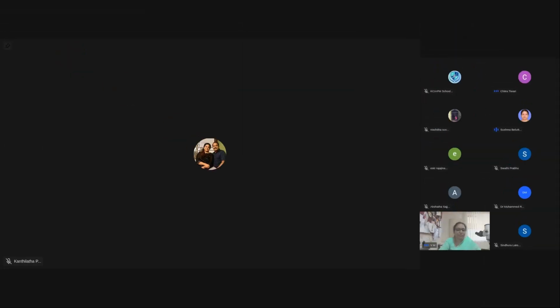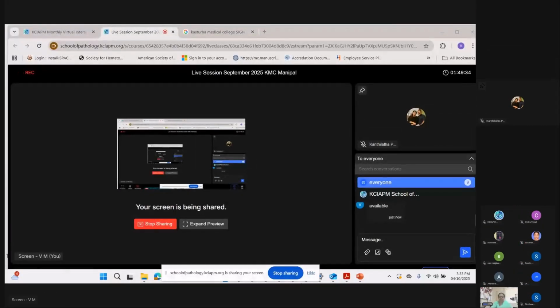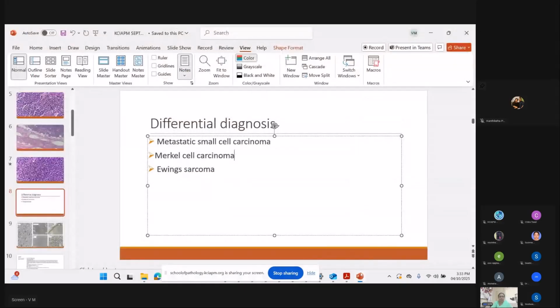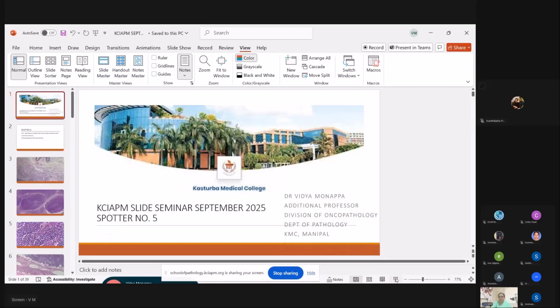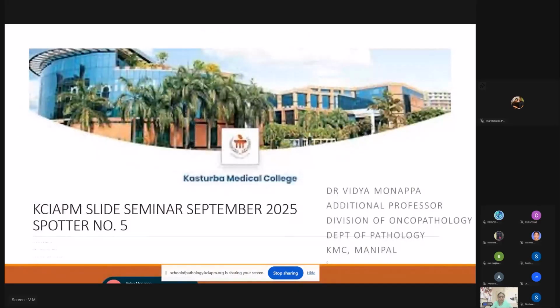Thank you, Dr. Chitra. Now I invite Dr. Vidya Monappa, Additional Professor of Pathology, to discuss this case. My slides are visible. Yes.